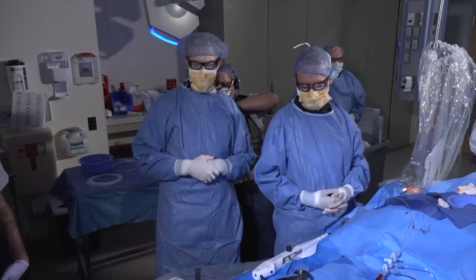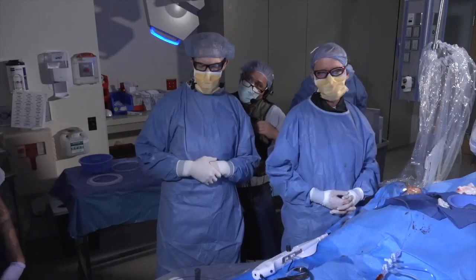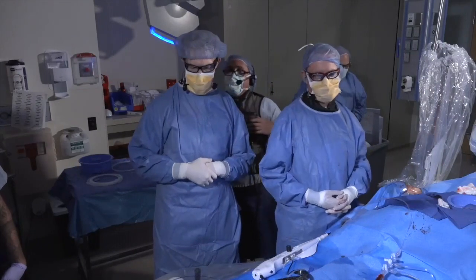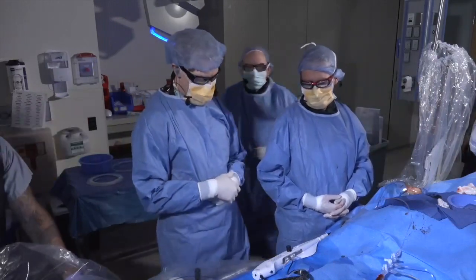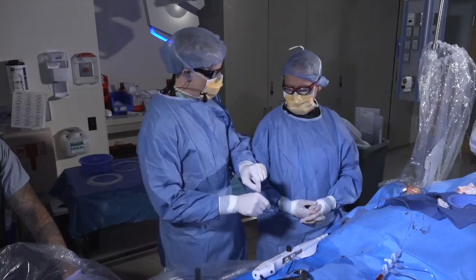I think this is obviously a case where I'd probably have access into the iliac and evaluate the iliac so I have a backup strategy that I can use quickly if the patient did decompensate. But assuming that the patient's hemodynamics are favorable, the LV function is reasonable, I think this is a case where you could easily go through without the need of hemodynamic support.